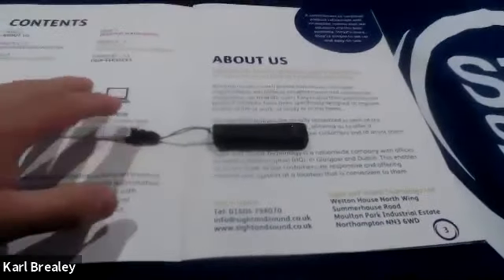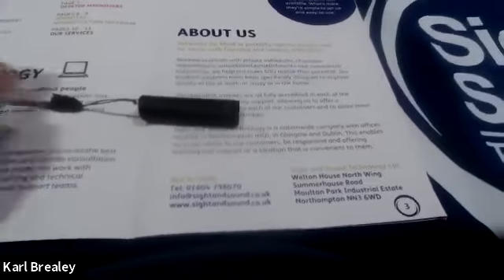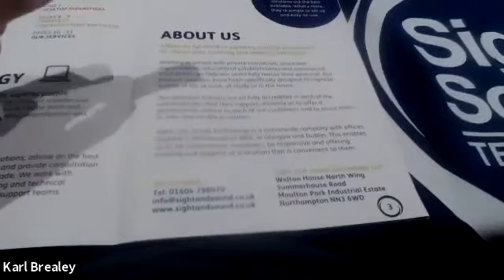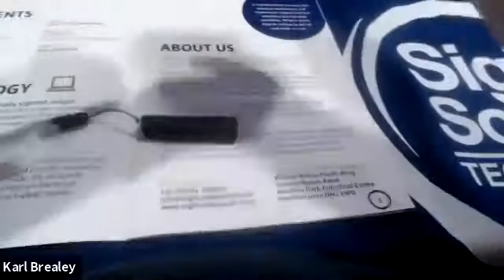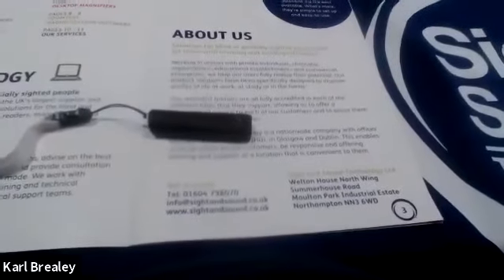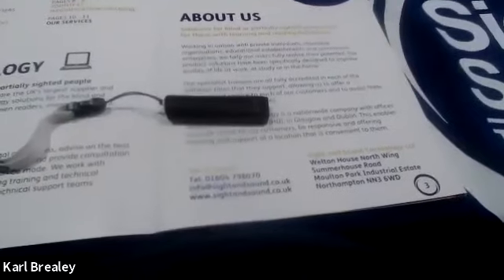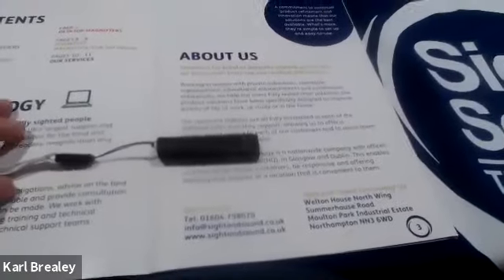That means you don't have the cable at the moment, isn't it? No cable at all. The only thing I have attached to this OrCam is a lanyard. It will work completely away from any cables, and if you are out and about and need to make sure the battery is available, you can take one of those power packs you use to charge your phones.